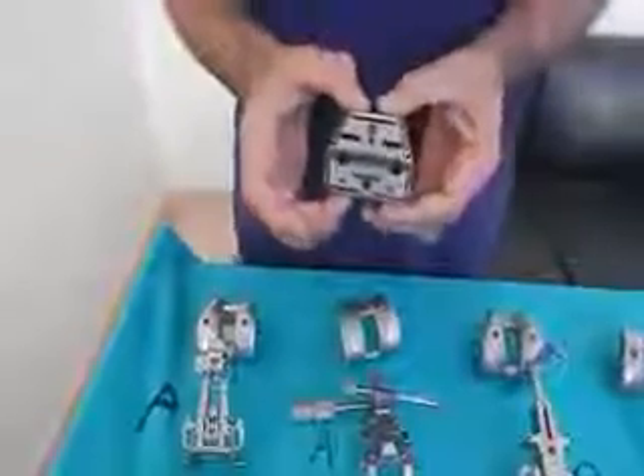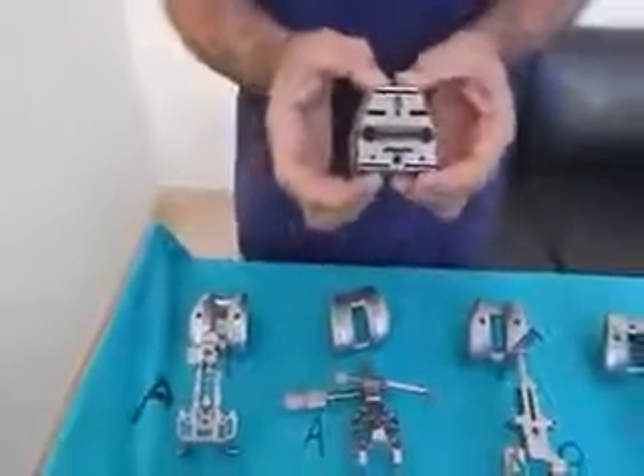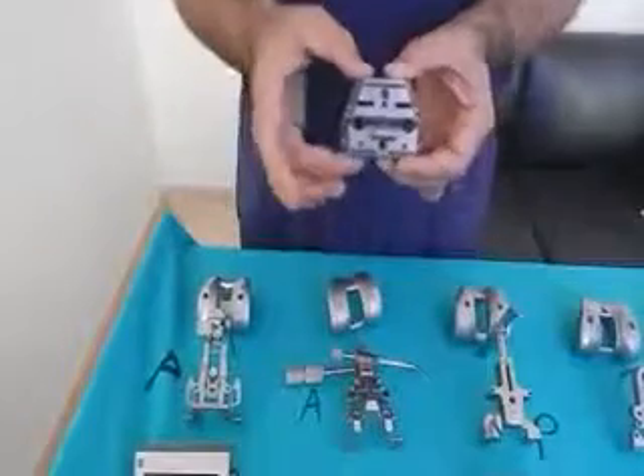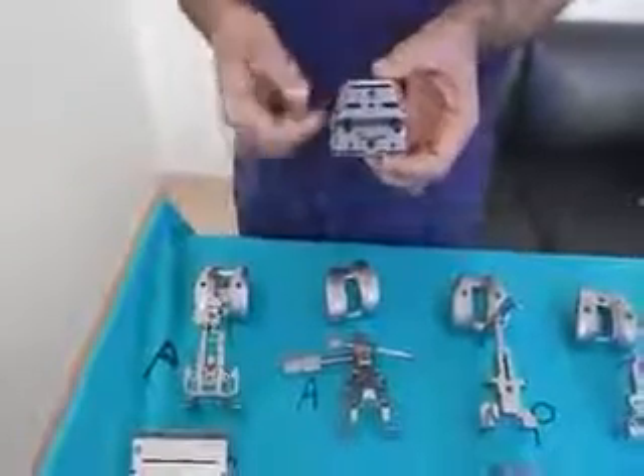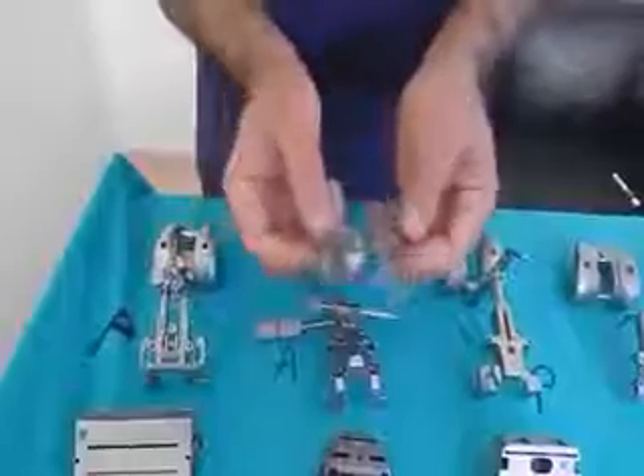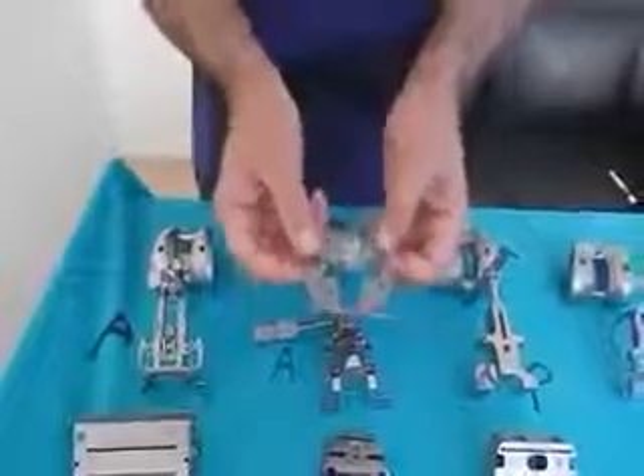If you want to downsize in an anterior referencing system, your block will remain at the same anterior reference position but you will cut more posteriorly. The tibial sizes are also pretty good and you can go two up and two down, which is an advantage over DePuy where you can only go one up and one down. Overall, it's a very good design for both CR and PS with a very low incidence of patellar clunk and painful patellar crepitus.